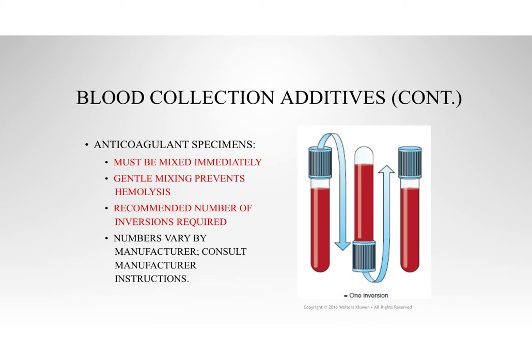And one of the biggest skills that you don't even realize you're going to learn, and may take a while to learn, is holding your hand completely still while doing another skill and not moving that needle. Because when you pop that tube off, you're immediately mixing it before you put it down. But you've got the needle still in the arm, so you cannot move. Okay? And we'll learn all about that in lab.